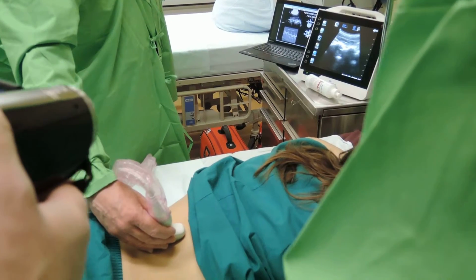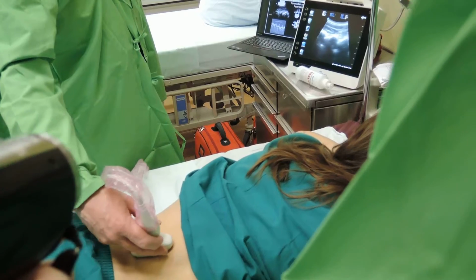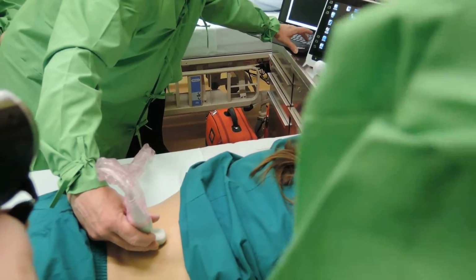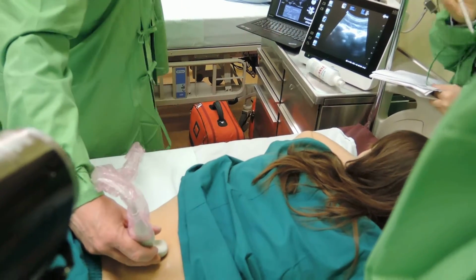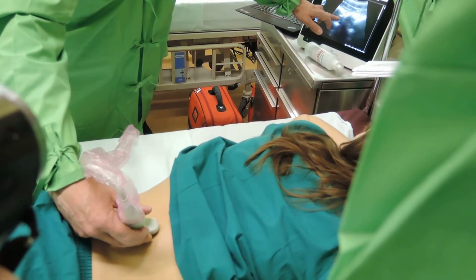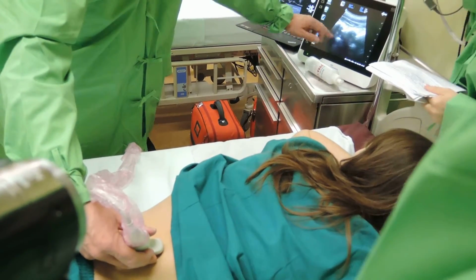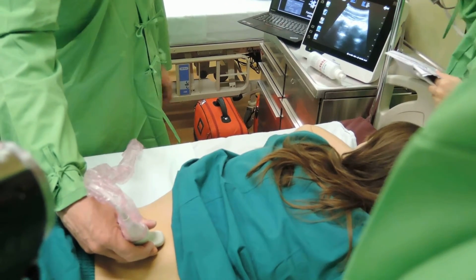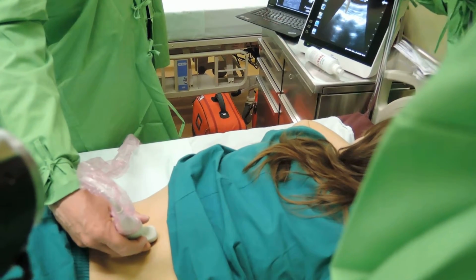And if one turns the probe a little bit, obliquely, now he will show what we do with the probe. We turn it a little obliquely. Like this, we have a paramedian view, an oblique paramedian view, along a slanted line. We have a look into the spinal canal, and then we see the spinal canal and the dura. This is the dura mater.